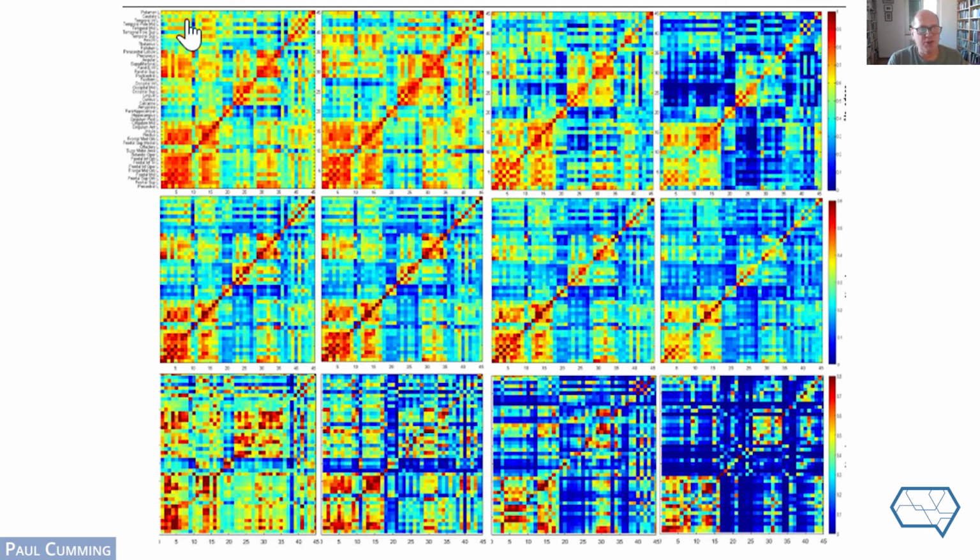And you see that there are zones where there's a high correlation. It's indicated by red. Never mind what regions they are. The text is far too small to read. But a normal brain shows clusters of brain regions that are interacting with each other and are sort of covariant, so that they have naturally high activity together in parallel. And other regions shown in blue where there's lesser correlation. And so within a series of healthy subjects, you could get a whole range of results, but the overall pattern is the same, that some regions of a healthy brain are sort of talking to each other and are entrained metabolically with each other in the normal operation of the brain. Next slide.